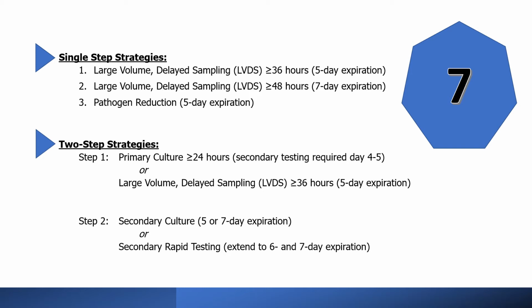Two-step strategies are a way to safely extend the life of the platelet by either using a secondary culture or using rapid testing. Primary cultures will be performed by the blood center, but hospitals may perform secondary cultures or rapid bacterial detection as part of their two-step strategy.